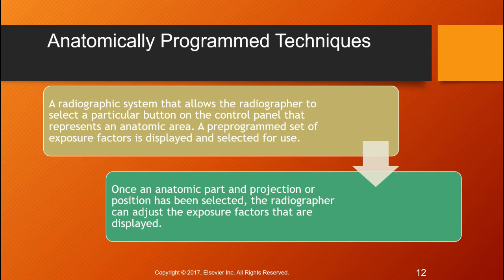So once that part and projection has been selected, the radiographer can adjust the exposure factors that are displayed any way you want to, but it has them programmed for you so that you just have to push one button for a chest, and the normal technique for an average patient will present.